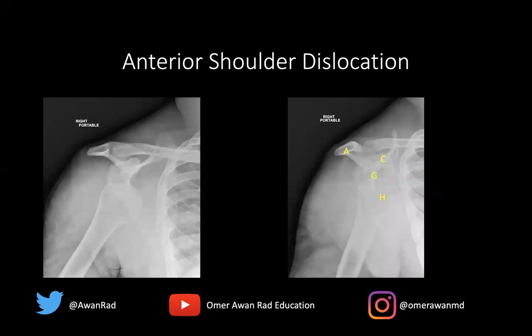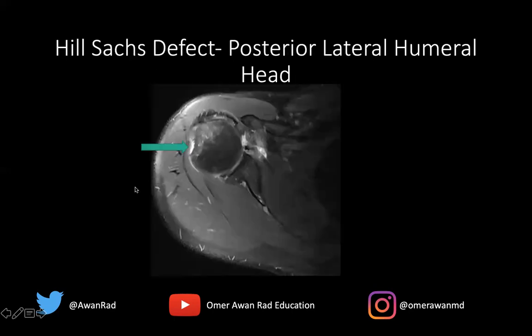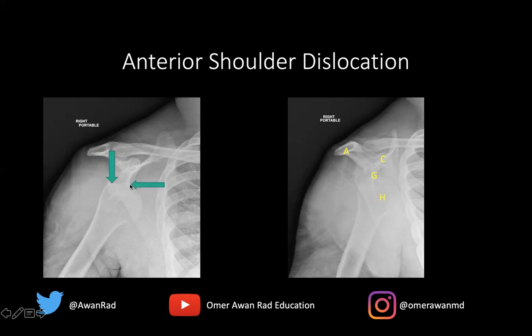I want to show what this looks like on an x-ray, which is probably what you're used to looking at. On this frontal view of the shoulder, we can see that the humeral head is inferiorly displaced with respect to the glenoid — this is the humeral head, this is the glenoid, and it's not articulating with the glenoid. The Hill-Sachs lesion is here: the posterior lateral aspect of the humeral head impacts along the anterior inferior glenoid, giving you the characteristic Hill-Sachs and Bankart lesions.